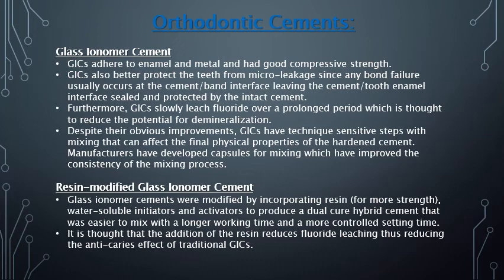Despite their obvious improvements, they have technique-sensitive steps with mixing that can affect the final physical properties of the hardened cement. Manufacturers have developed capsules for mixing which have improved the consistency of the mixing process.